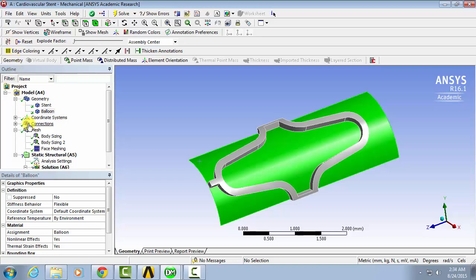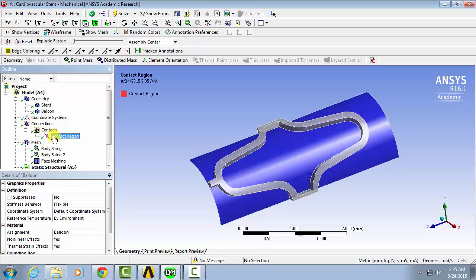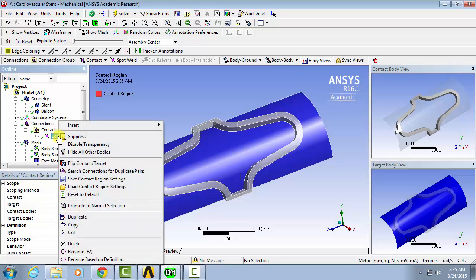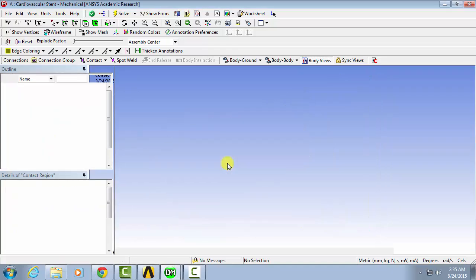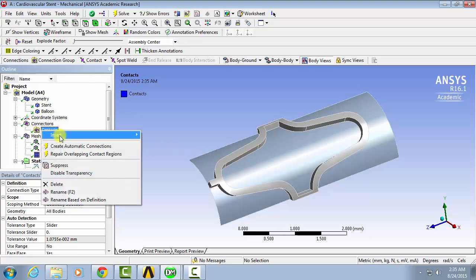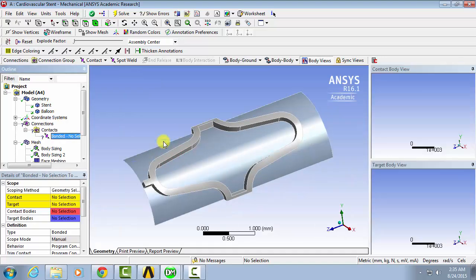Now using connections, we can start editing the way that the interface between the balloon and the stent are going to interact. So we can go under connections, and under contacts, there will be an automatically generated contact region. Now you can either edit this one, or create your own by just deleting this one, and insert manual contact region.